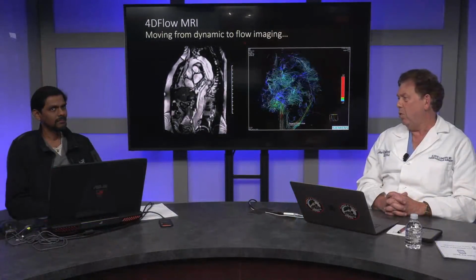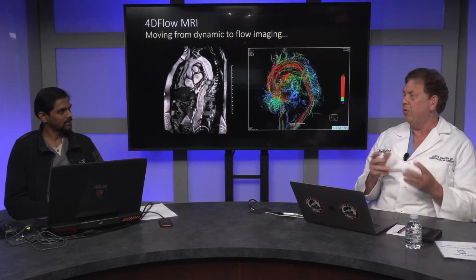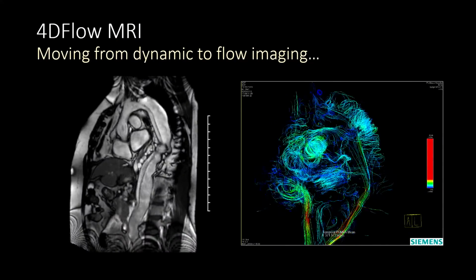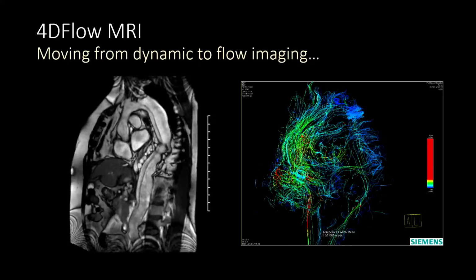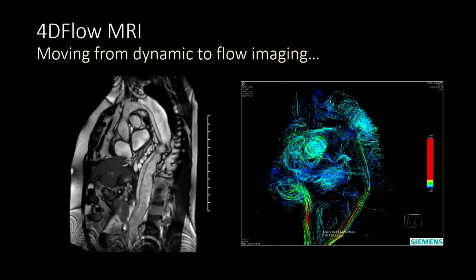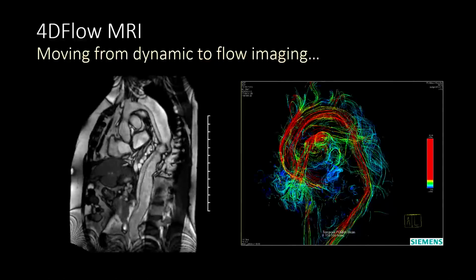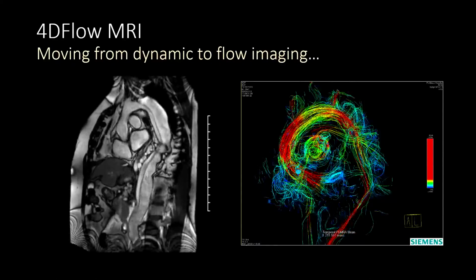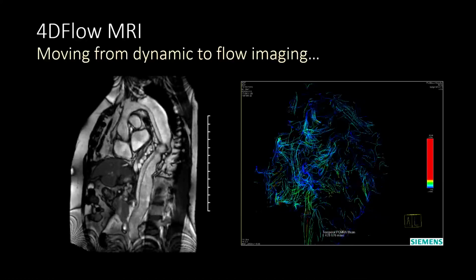What we're closing with here is this picture of 4D flow. 4D flow is real flow. It's not computed flow. This is a measurement of actual flow. And where we're moving to is thinking about getting a dynamic CT, which gives us the spatial resolution that we need, and potentially overlaying on top of that a picture like this, the 4D flow.